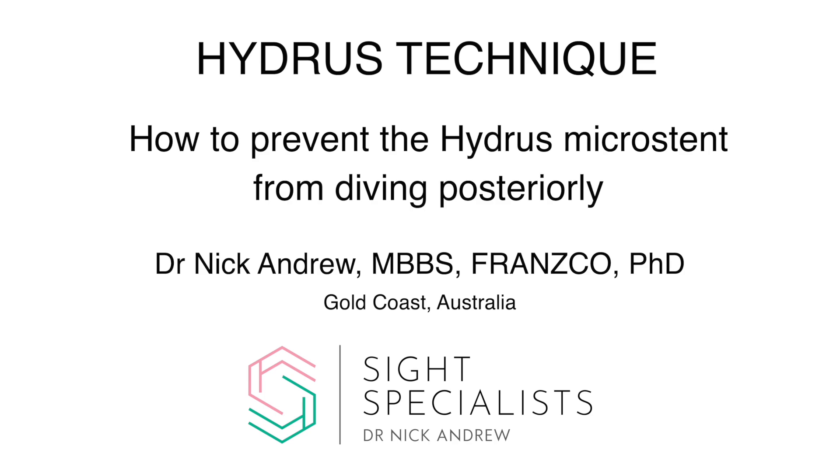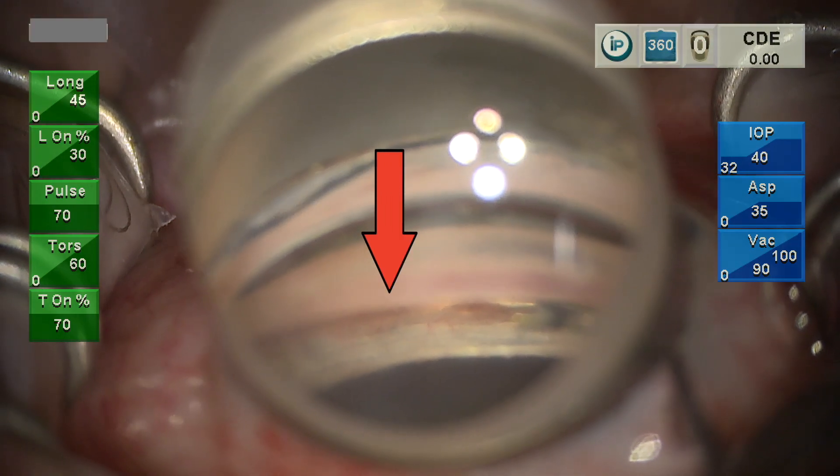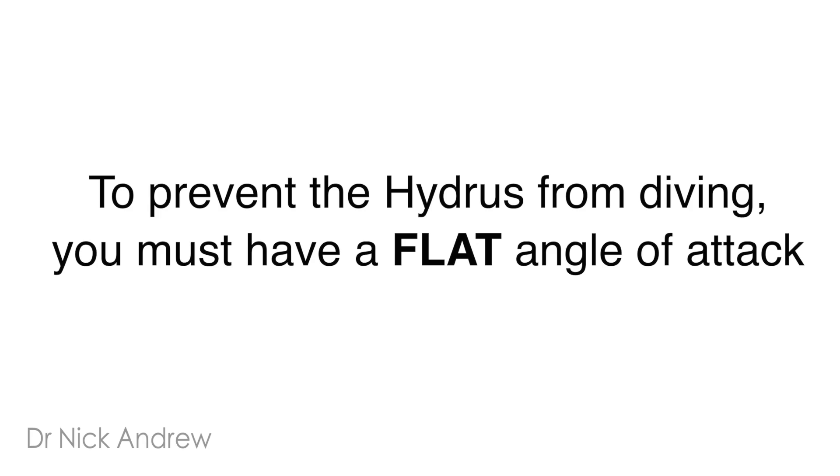This video describes the implantation technique for the hydrus micro stent and explains how to prevent the stent from diving posteriorly. This is an example of what we don't want: the distal portion of the hydrus stent exiting Schlemm's canal and diving posteriorly towards the iris root. So to prevent the hydrus from diving, you must have a flat angle of attack.